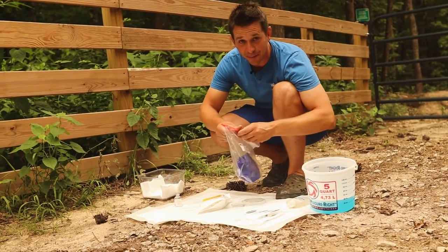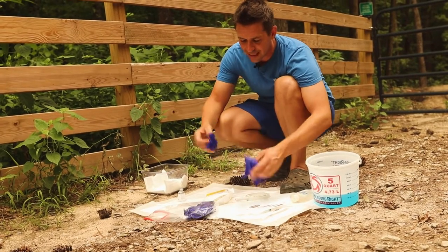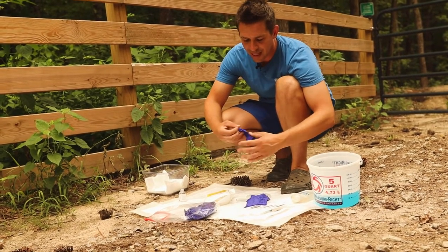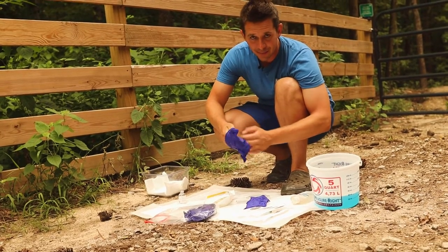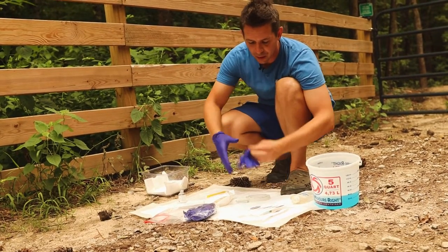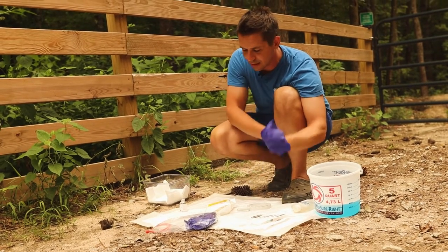Now that we have all of our supplies, we're going to go ahead and get started. I'm putting on a pair of gloves. These can actually cause miscarriages in women, and it's very important that a woman never handle these directly. Honestly, anybody should definitely put on gloves — latex gloves — whenever they're handling these hormones like this.